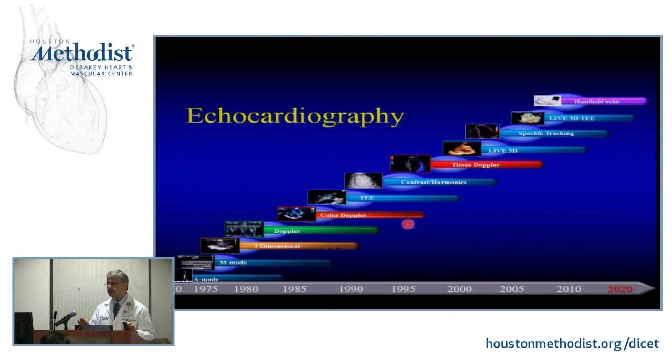And with the same principle, the only principle that really came different is Doppler. All the other imaging is the same principle: localizing and looking at the intensity, and how real time can you see it, what's the resolution that you could see it at. And the other one is flow and flow calculations. And among all the technologies of imaging, certainly Doppler is number one for looking at various flow. Globally, I think MRI is certainly great, but CT is problematic because of its time resolution.